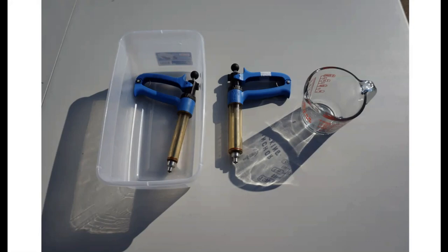One of the questions that came in is, if I'm using this multiple dose syringe, and let's say I'm giving a 5 cc Clostridial vaccine in that 50 cc barrel, it can hold 10 doses. Do I need to make sure I change that needle before I go back into the bottle to refill it? Absolutely. I never want to go back into the bottle with a dirty needle. So I'm going to change that needle before I go back into that bottle to draw up the next dose. As far as the animal goes, I may use that same needle on multiple animals as long as the needle hasn't gotten dull or dirty or bent in that situation. So yeah, don't ever go back into the bottle with a dirty needle.